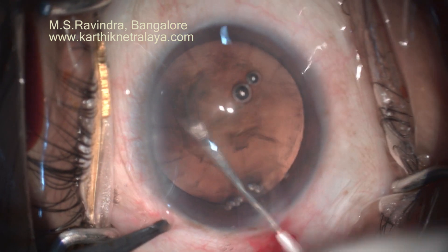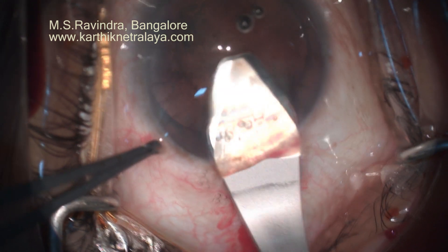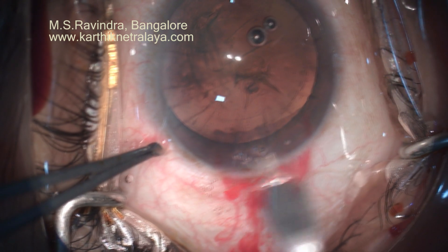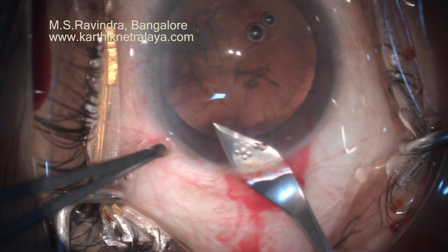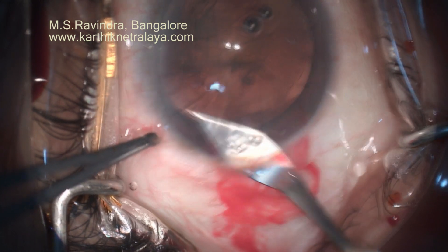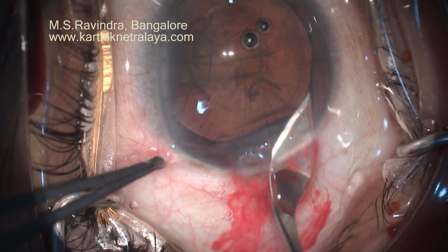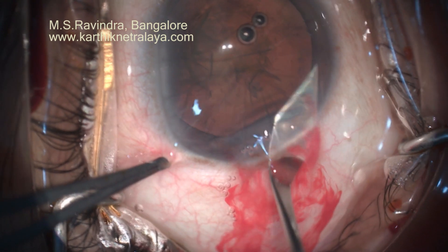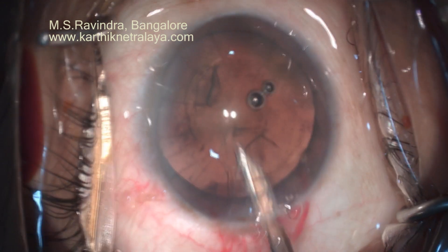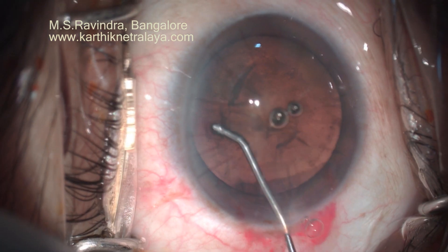The anterior end of the tunnel is enlarged with the 2.8 millimeter keratome so that the endothelium is not damaged at all during nuclear delivery. This does not increase the SIA significantly — the SIA of this tunnel would be 0.4, and on extension it will become 0.6. That is the SIA we could expect by such a tunnel construction.